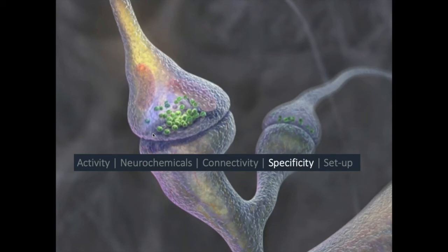Yeah, no, those are really good questions. So it's good to choose a reference metabolite that's acquired at the same time, because there's always a risk, particularly with brain stimulation, and we're slightly concerned that we might be causing some kind of shifts in water concentration, for example, that might just shift all our metabolites. So you want to have something that's acquired at the same time so you can see it's a specific change, an increase or a decrease. We used to use NAA, which is not a good reference metabolite. It was the only one we could actually acquire at the time in that particular sequence.